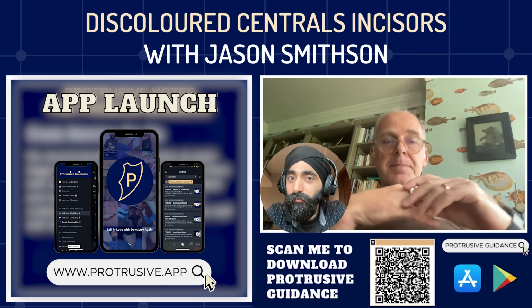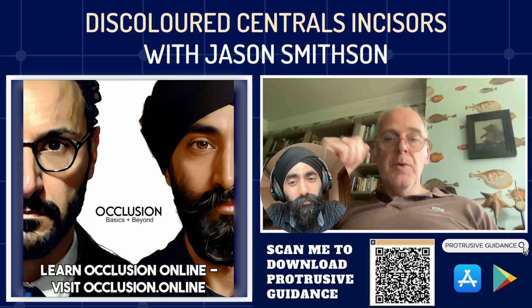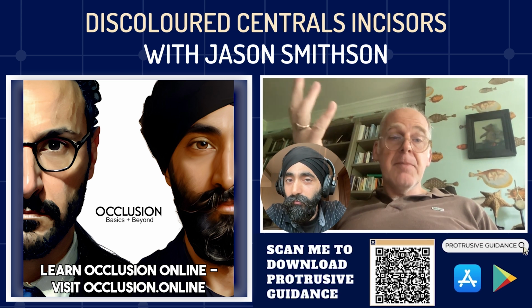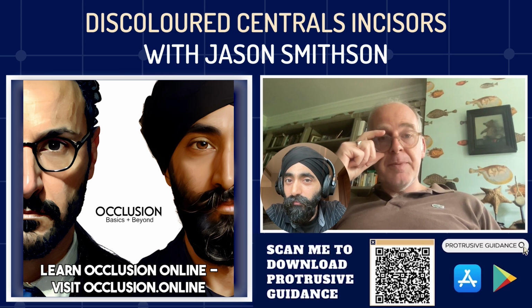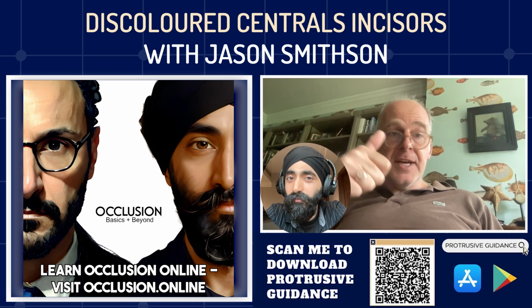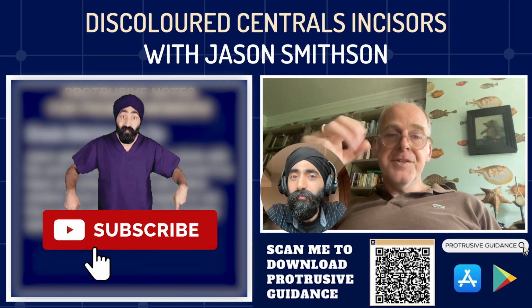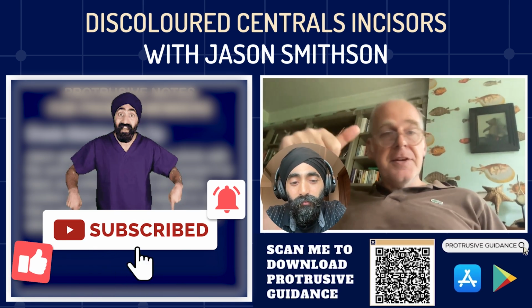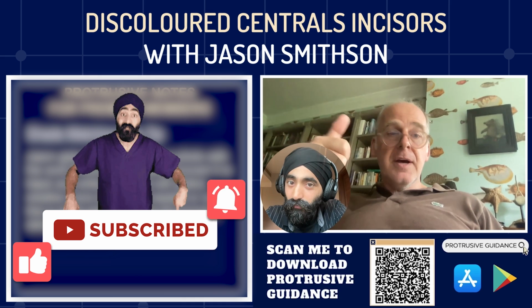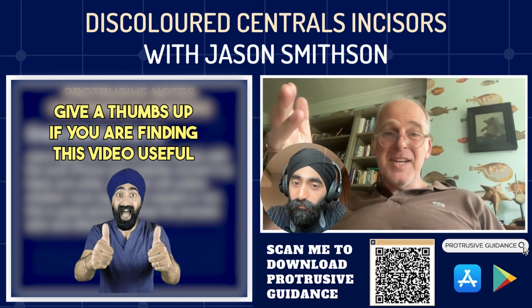Now, obviously, in a busy practice, including mine, that's a huge faff. So what we do is, and most of us have nursing staff who are a bit younger and probably a bit better with IT than we are, I get my nurse just to take an iPhone photo. So I'll put a couple or 3 layers of opaquer on, and then she'll take an iPhone photo, instantly convert that into black and white, which takes literally seconds.